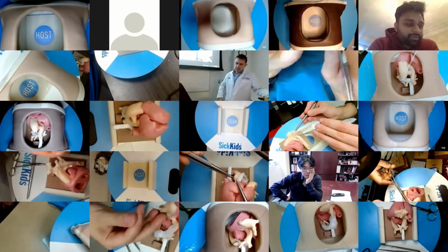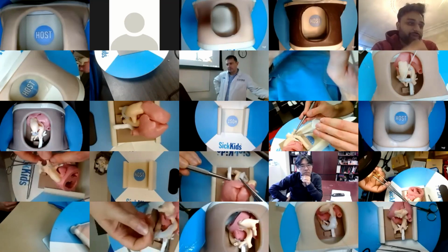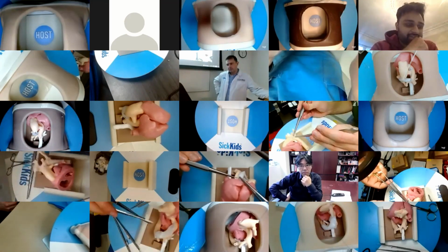Okay, yeah, because when I've tried it in the past, that's the problem I've had. I've overcompensated and trimmed too much, and then it flattens the DKS at the end. Yeah.